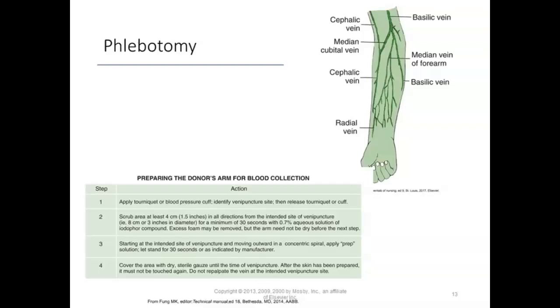because at that point, the bags come pre-packaged in a sterile package, and the donor tech has your information, and once they open that pack, those stickers, that W0365, that long number, they then put that number on your information sheet to keep track of everything. So the donor tech confirms identity. All bags and tubes must be labeled. The best site to draw from is the antecubital area, because that's our largest vein, right?